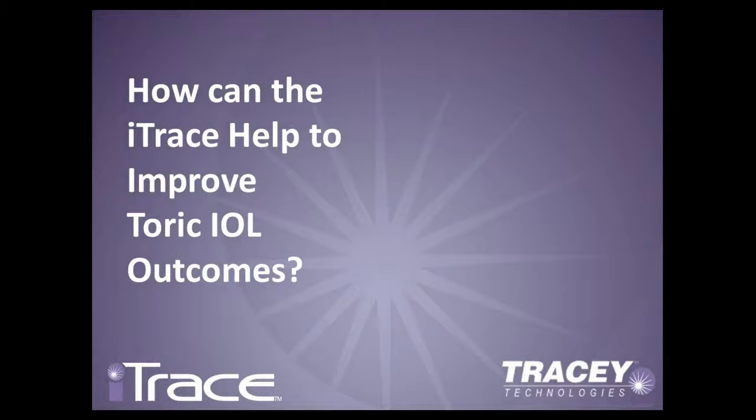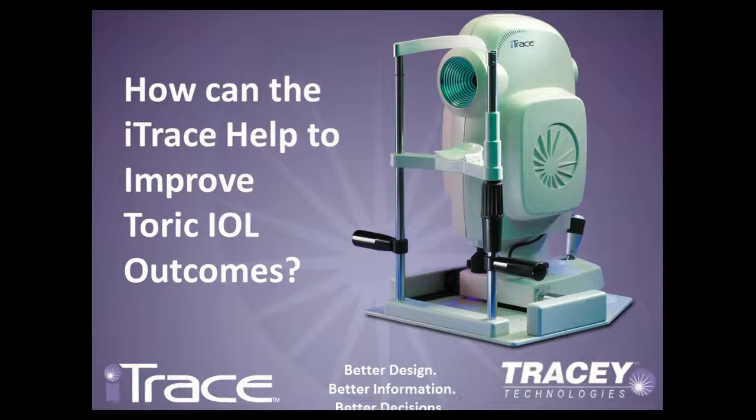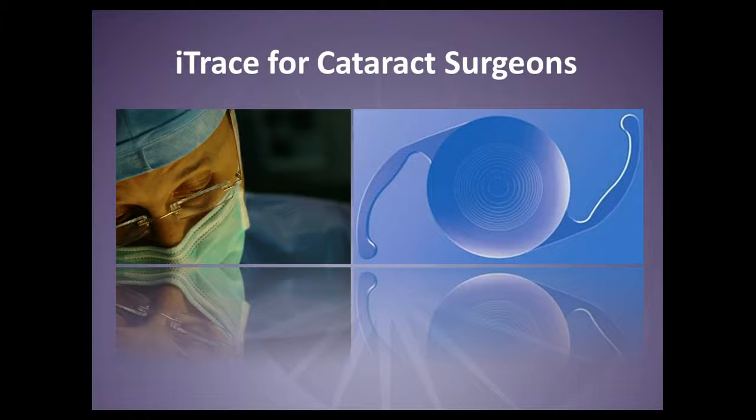Welcome to our webcast. Here we explore how the iTrace can improve your Toric IOL outcomes. The iTrace is a powerful tool for analyzing visual function and the source of aberrations, but it is equally powerful for cataract surgeons implanting premium and Toric IOLs.